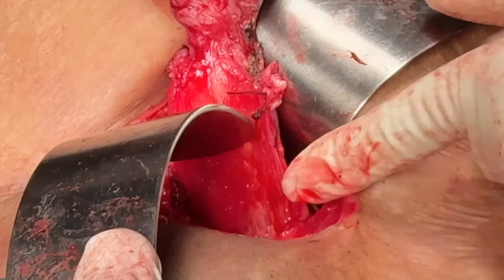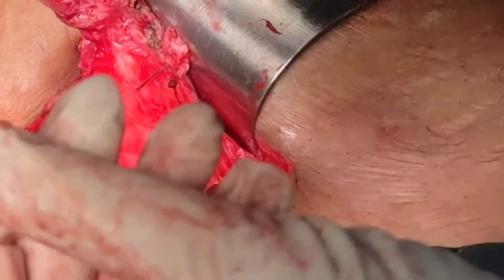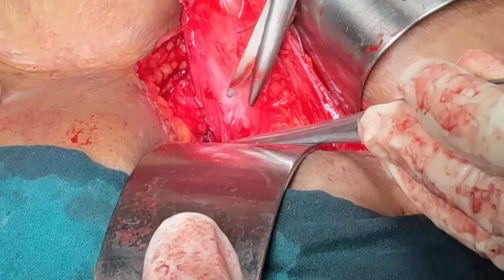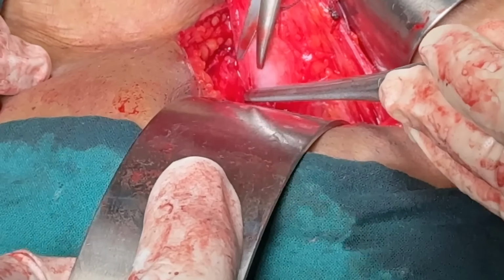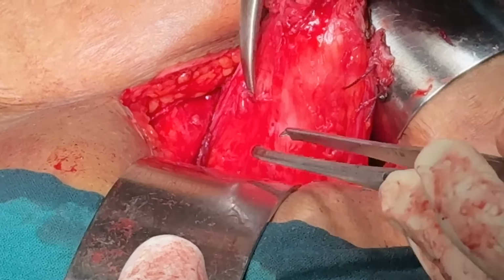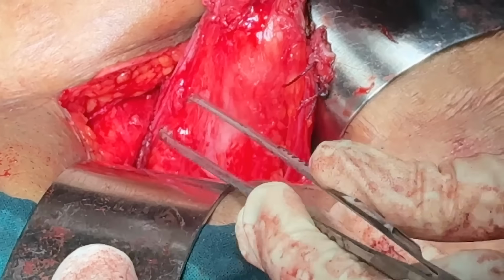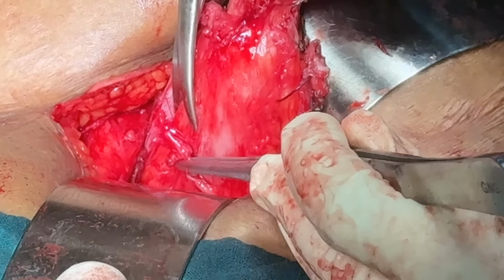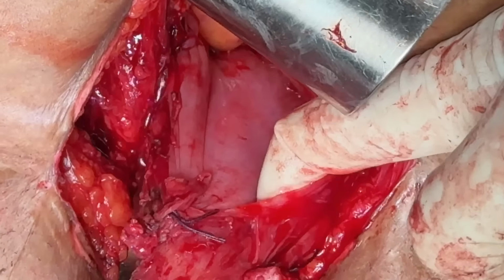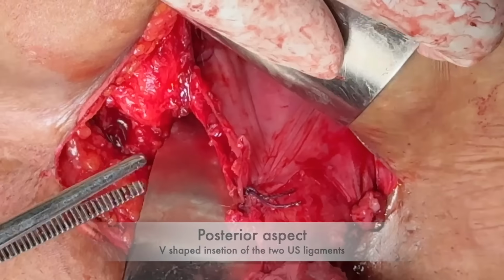To go to the lower pedicles, that is uterosacral and angle of the vagina, let's dissect the bladder a bit more to get a clear surface so that we are 100% satisfied and safe. We must also check the posterior aspect. You can see the V-shaped attachment of the uterosacral ligaments here.